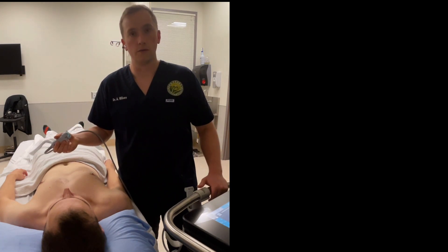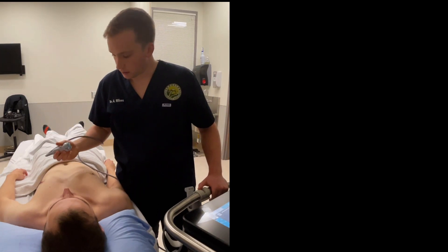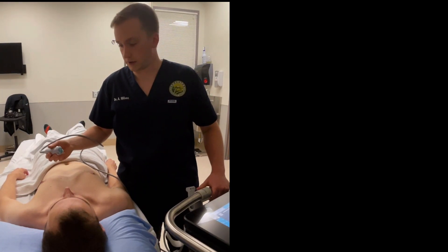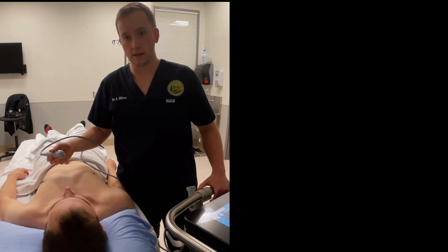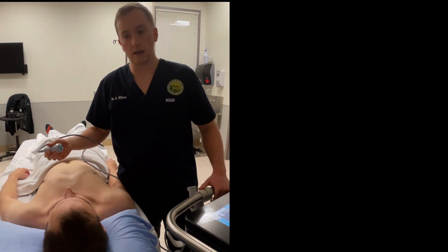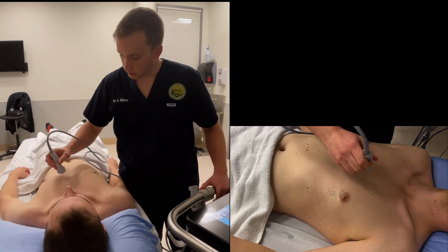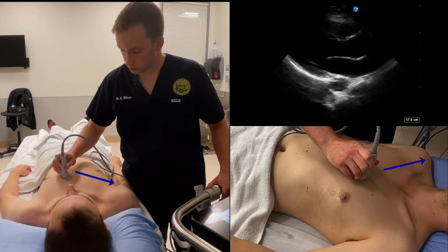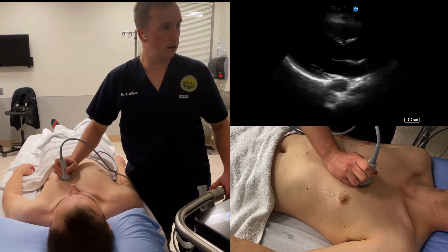To begin, we'll start with the parasternal long axis. To identify the location for the parasternal long axis, you ideally want to go in the third or fourth interspace immediately left of the sternum, with the probe marker facing the patient's right shoulder. I'll do that here.